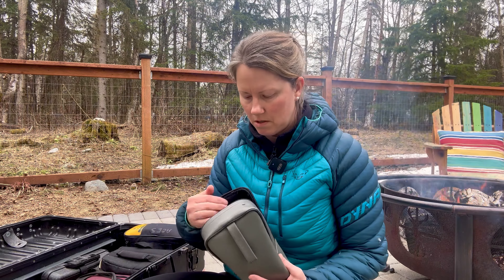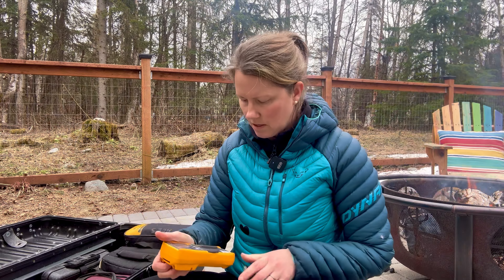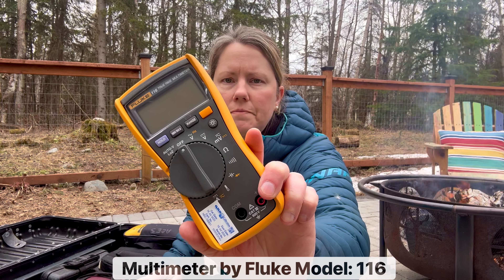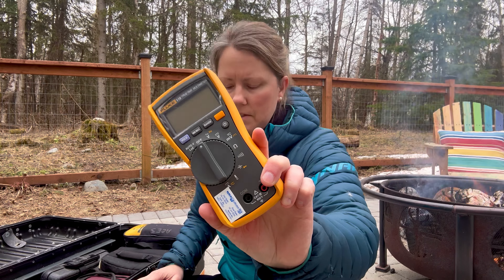I have my multimeter — this one's a Fluke. It does volts, amps, ohms, and temperature as well.